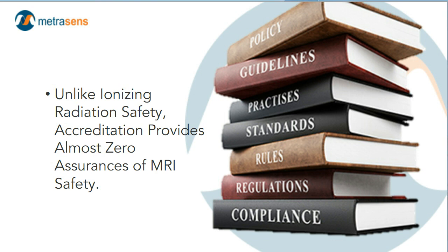And that's really where we find ourselves today, where the rules that the accreditation organizations, the manufacturers, the state licensure authorities, or the FDA have with respect to point-of-care patient safety or staff safety don't really exist. So that puts a greater burden on everybody who helps to shape the physical environment and the process that occurs in it, which circles me back around to my original premise that we need to increase the level of involvement of the designers.